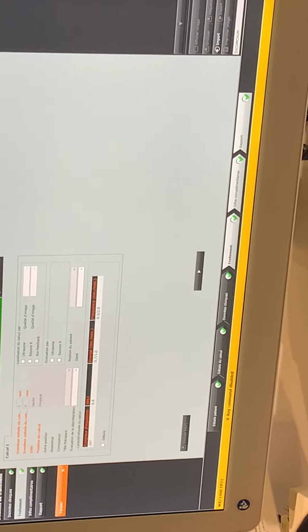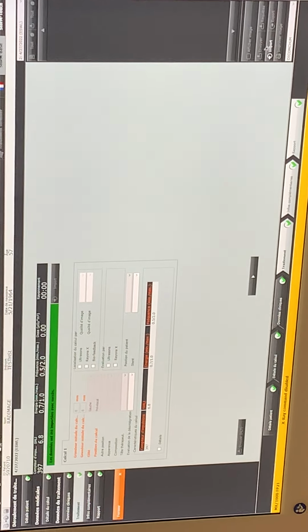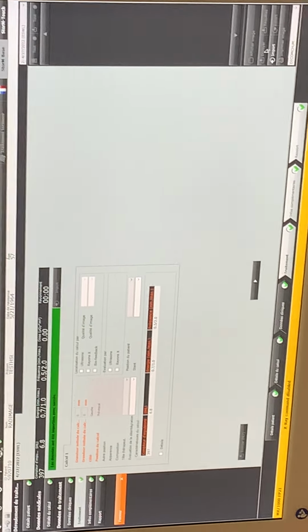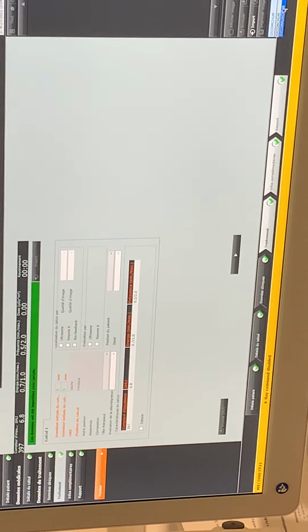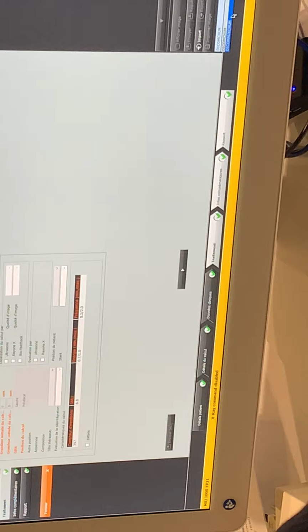Normally, all of the pictures are chosen. Send button, which is grayed out at the moment because we do not have any pictures. Here you can change the PACS system, but most of the time you will use the normal DICOM and not the DICOM auxiliary.